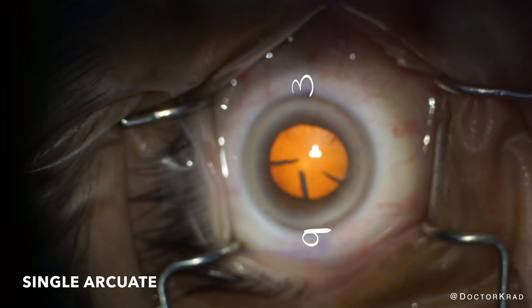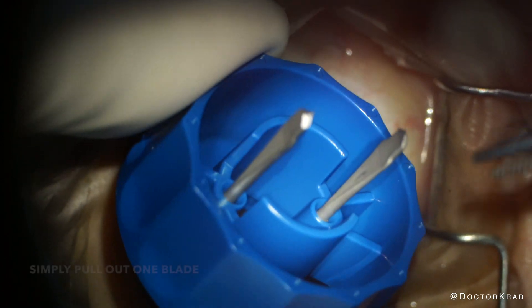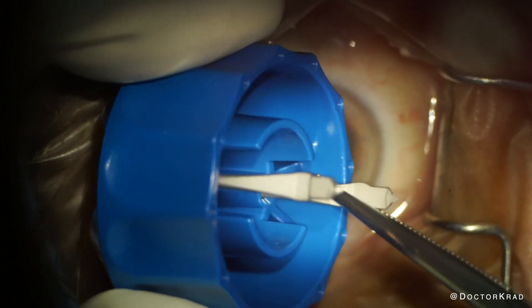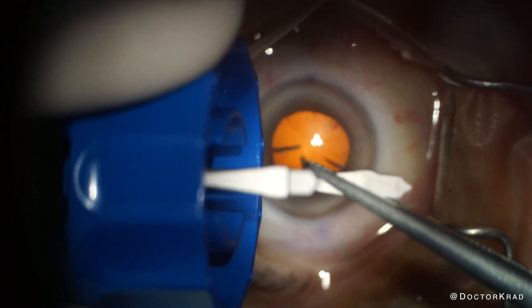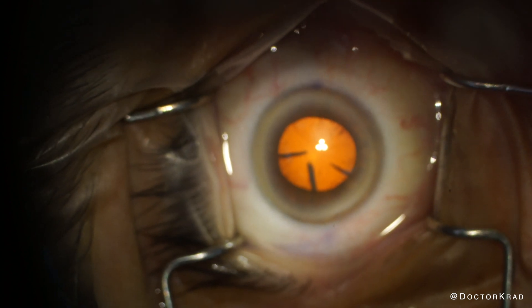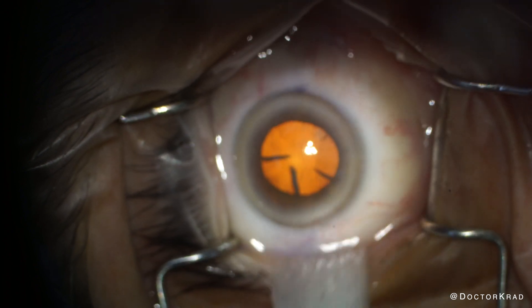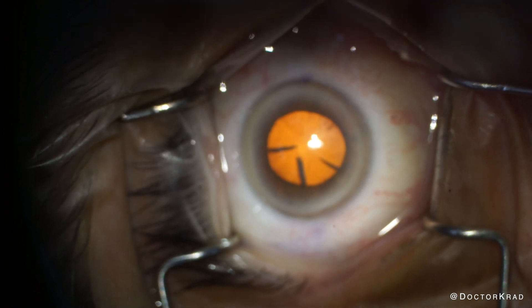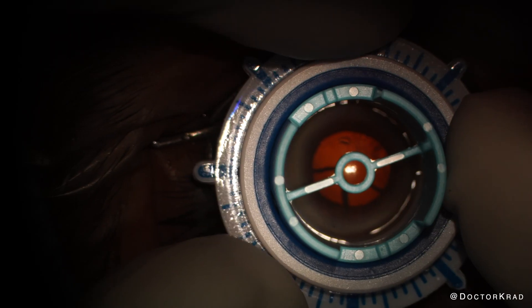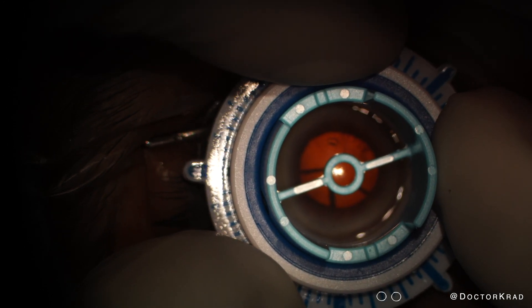Next, I'll show you how to create a single arcuate incision with the ARC Duo. You take the blade that you want, whether it's the 9mm or 10mm optical zone, and you just use a forcep like a mosquito and pull one of the blades out directly — just like this. Now you have a single blade, and you can place this single arcuate wherever you like. You need to make sure the ocular surface is wet with BSS, so I'm using a wet sponge to moisten the ocular surface. Here I'm using the light blue template, which indicates a 30 degree arcuate cut. I orient the template at a 20 degree axis, and each small tick mark is 5 degrees.